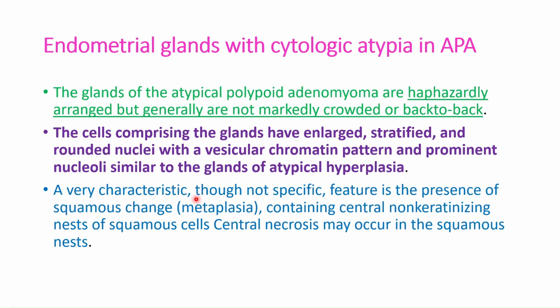A very characteristic, though not specific, feature is the presence of squamous metaplasia, in which a central non-keratinizing nest of squamous cells shows central necrosis inside the squamous nest.